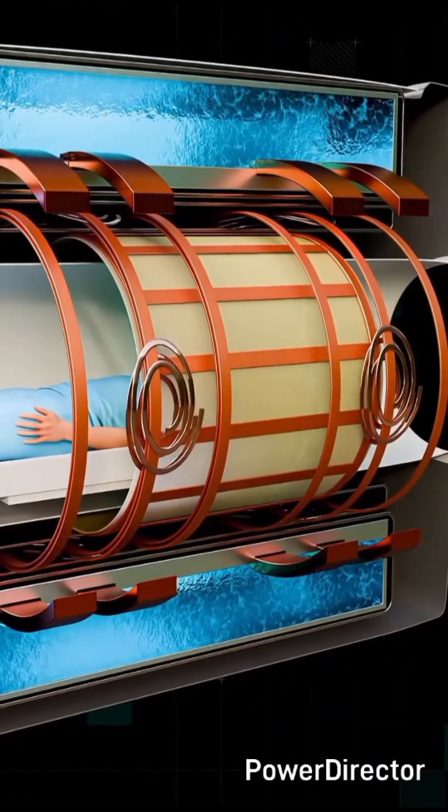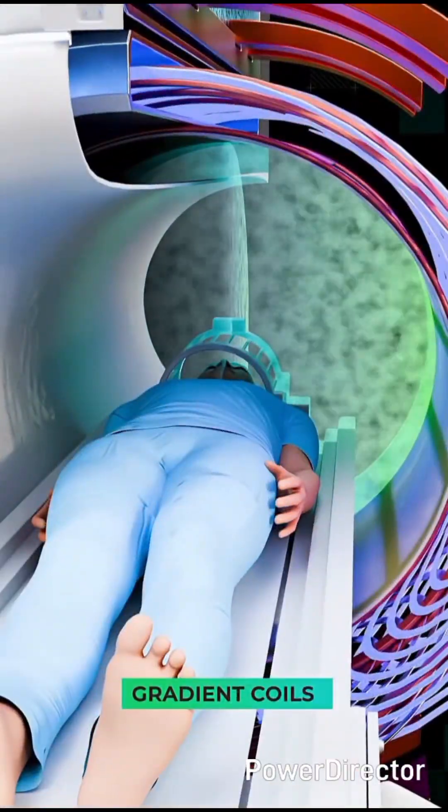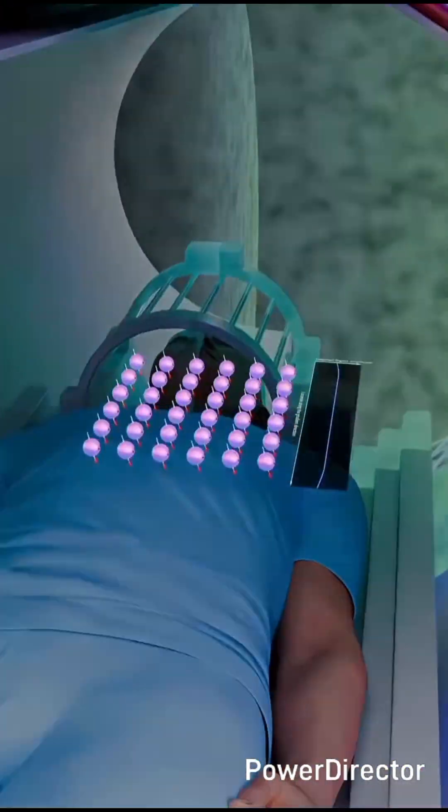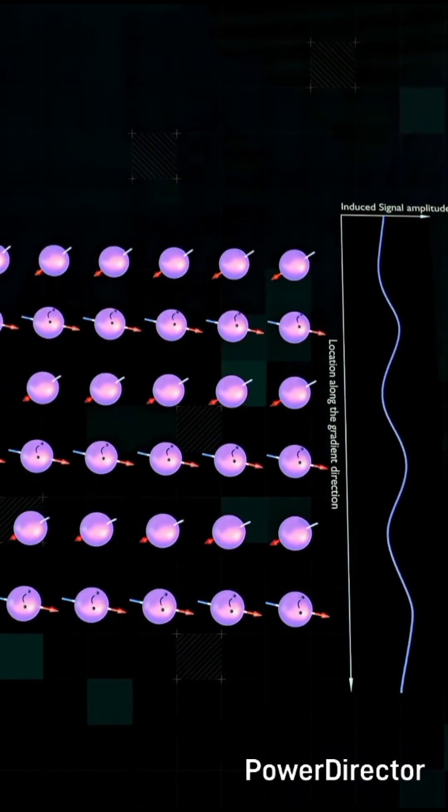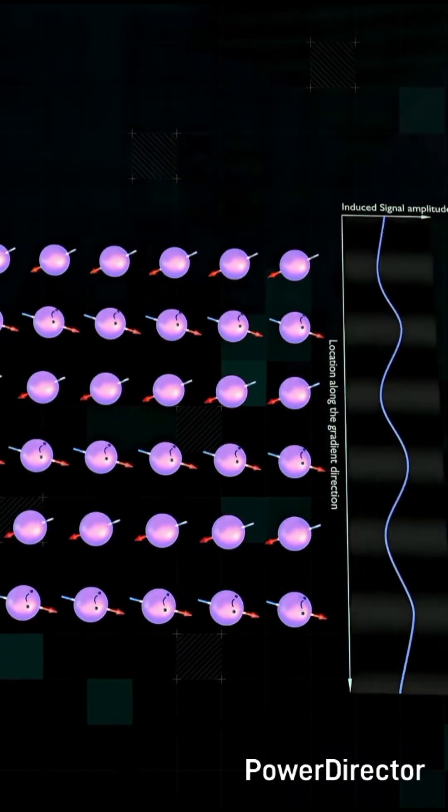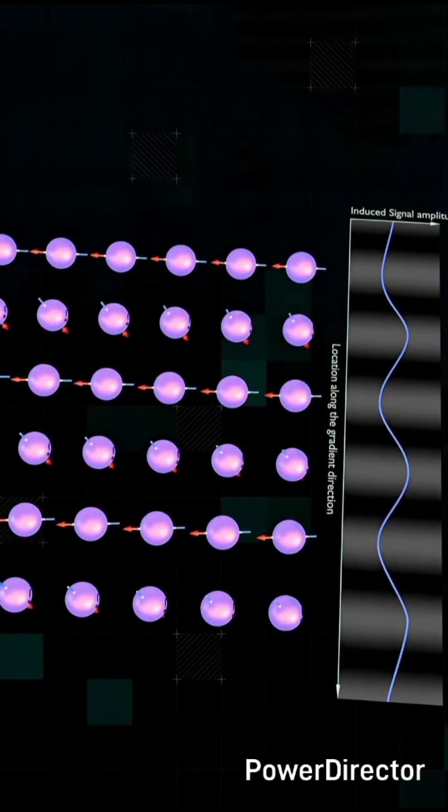To deal with this, these large spiral coils are activated. They create tiny variations in the magnetic field. They make protons in different parts of the body wobble at slightly different phases. This transforms the signal into striped patterns, black and white bands that encode spatial information.